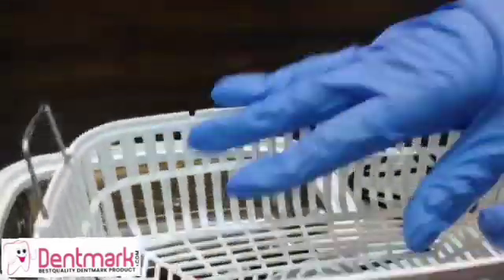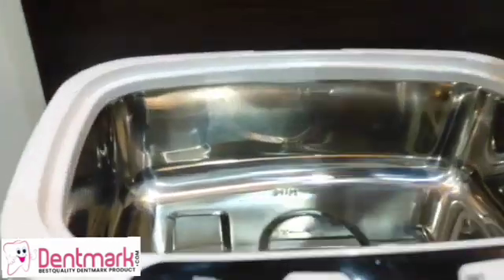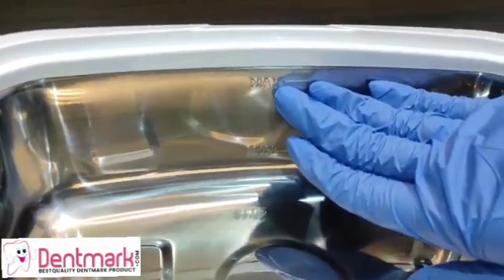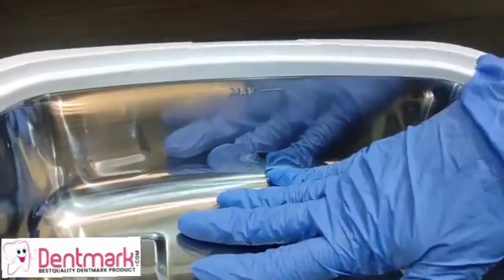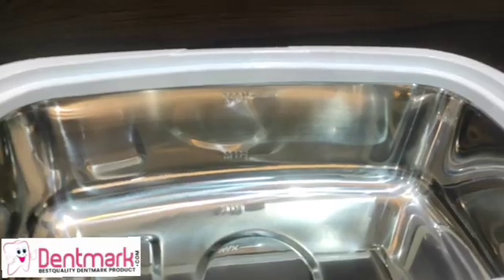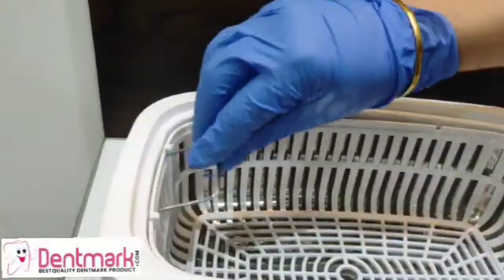Inside there is a basket which is removable — detachable — and in this we keep our instruments for sterilization. This is a 2,500 milliliter tub. This line shows the minimum amount of water you can use, and this is the maximum. Please remember: whenever you are using this cleaner, always put in water, otherwise the heating element below will get spoiled.